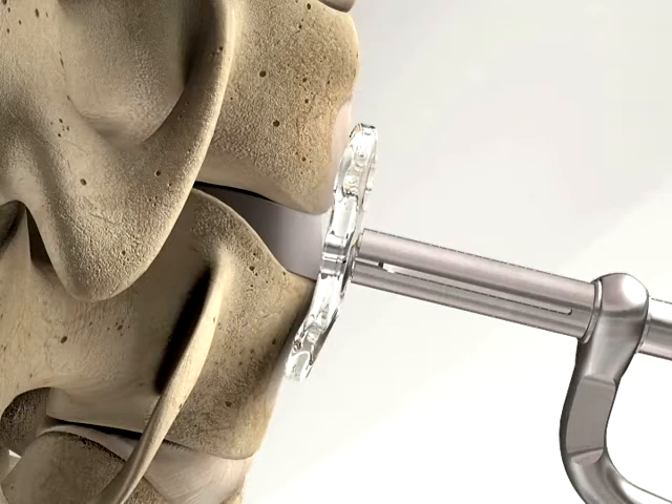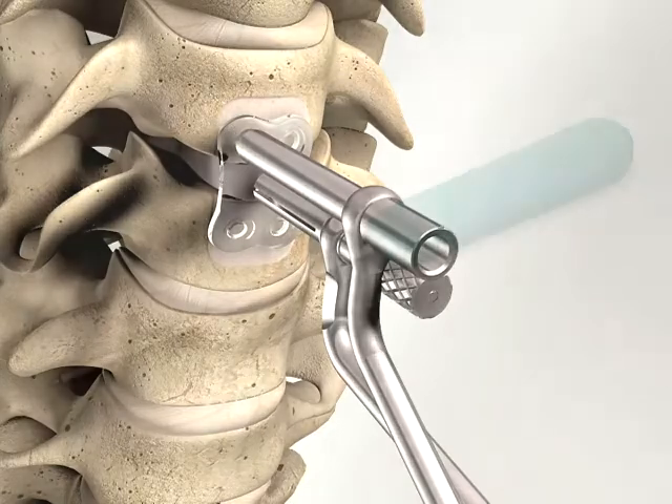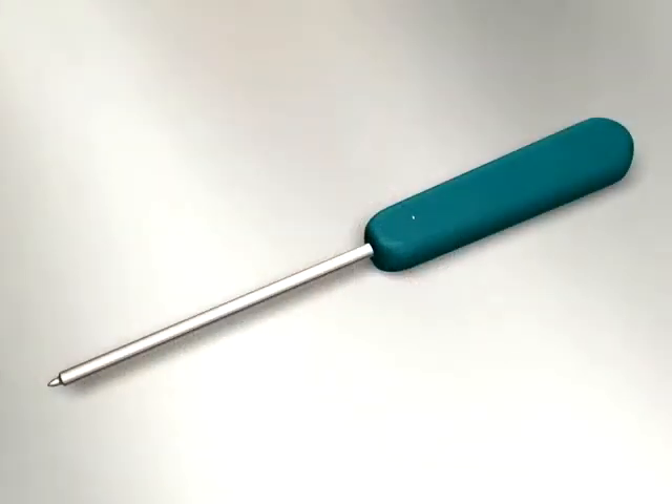Once contouring of the plate has been completed, it can be attached to the plate holder. Before drilling, an initial starter hole for the drill has to be made. Therefore, the bone punch instrument is used.